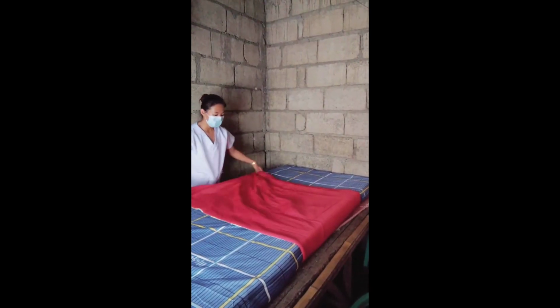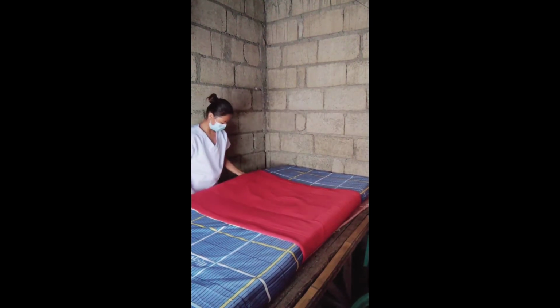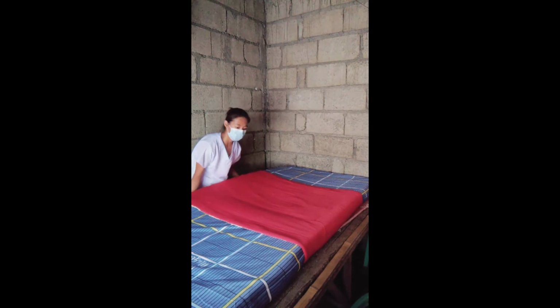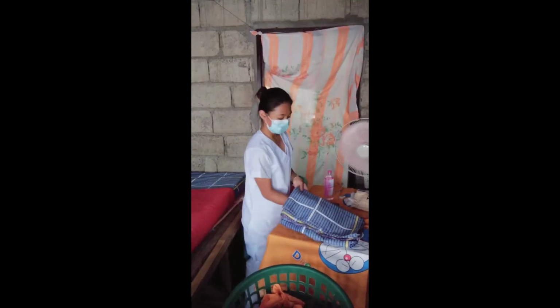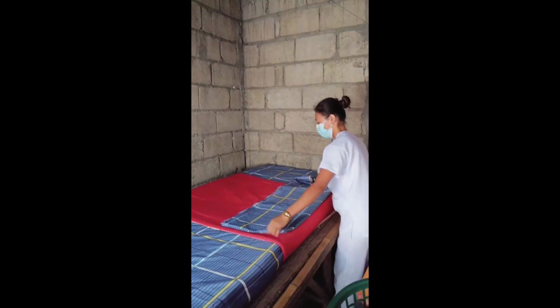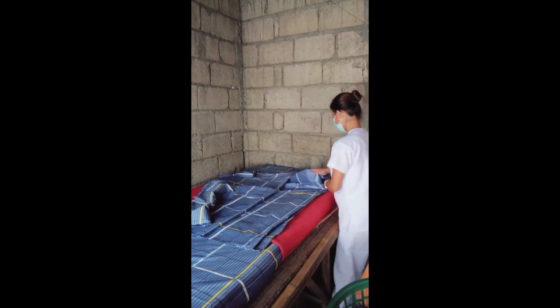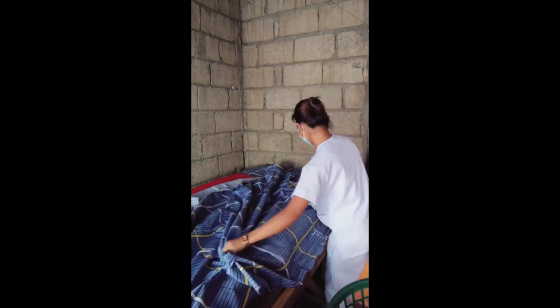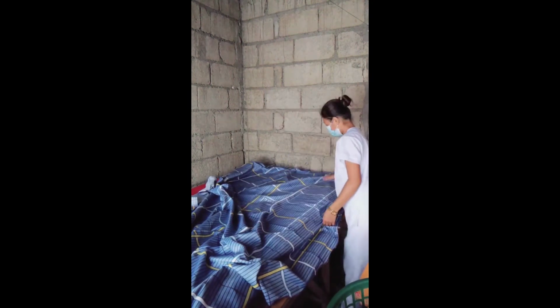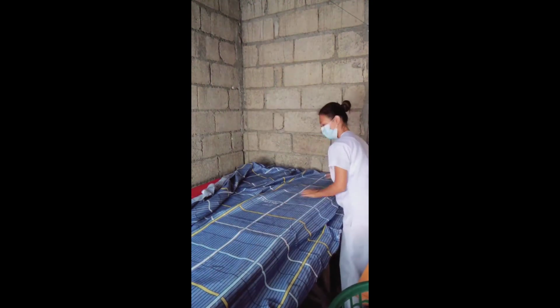Next, smooth the folded draw sheet over the bottom sheet and tuck it over the mattress. If needed, apply a waterproof pad over the draw sheet. Then place a blanket on the bed with its top edge parallel to and about 6 to 8 inches below the top sheet. If desired, place a bedspread similarly over the blanket.